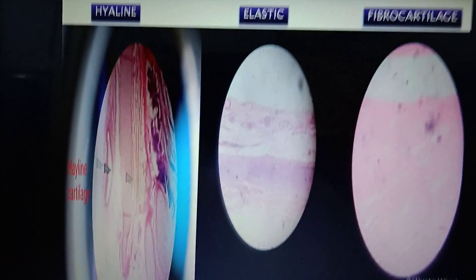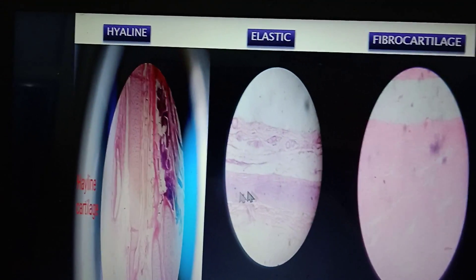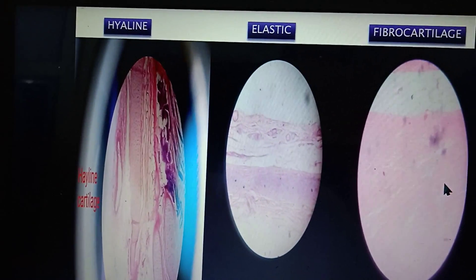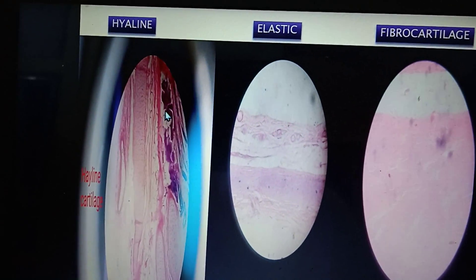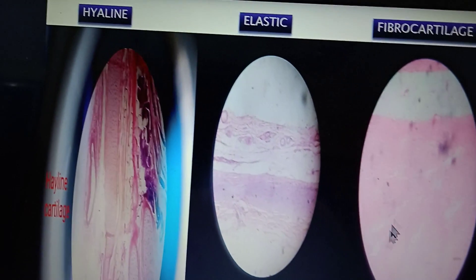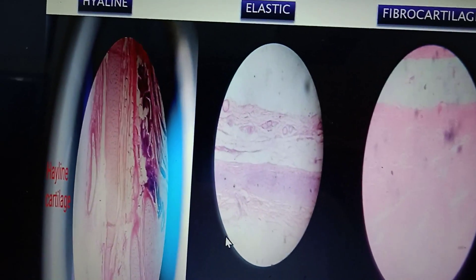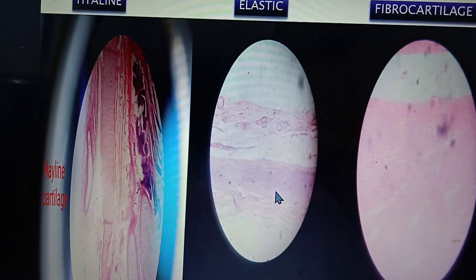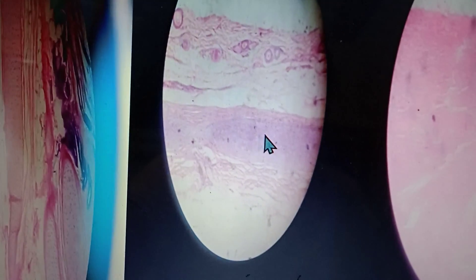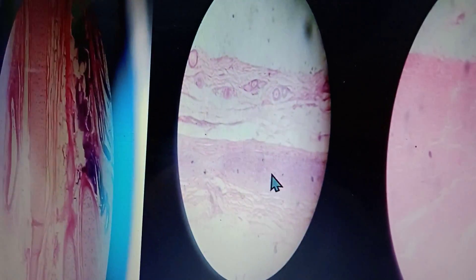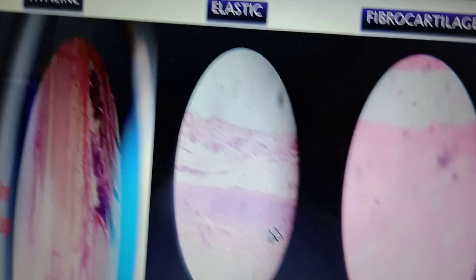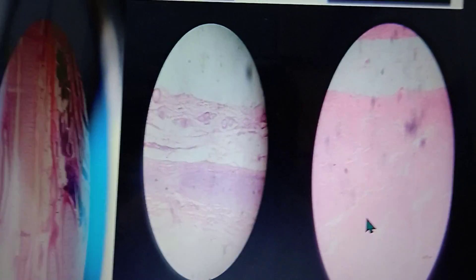Comparing hyaline, elastic, and fibrocartilage: the main difference is that cell nests are present in hyaline cartilage; in elastic cartilage the chondrocytes are compactly and densely packed; and in fibrocartilage the chondrocytes are arranged in chains.